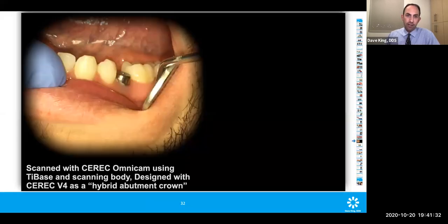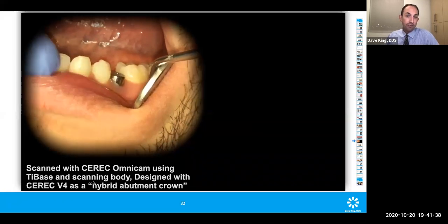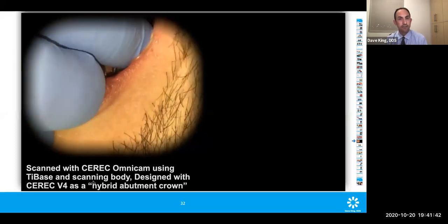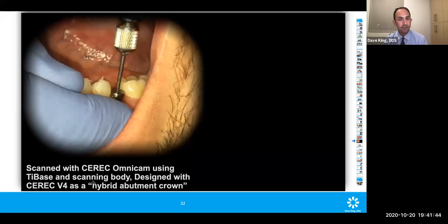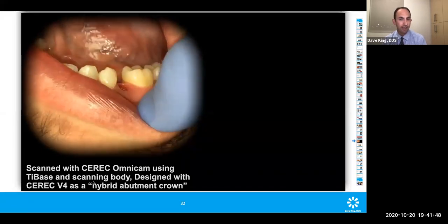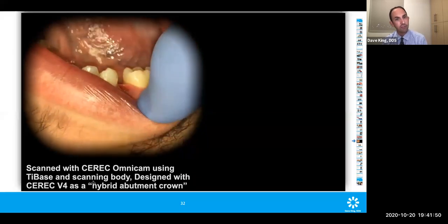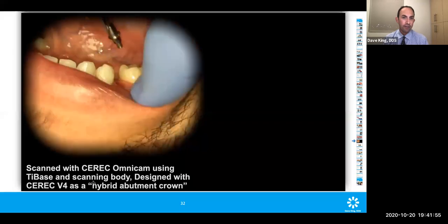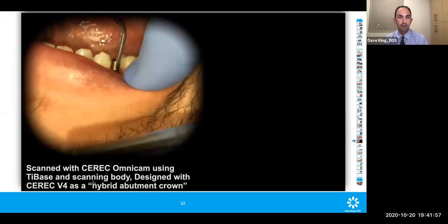All right, moving on. So I'm going to show you just a couple of videos of the actual scanning process using CEREC. So you can see me removing the healing abutment there. And this is one of my dental assistants in Albuquerque. We're going to take a look at the implant that's in place. And this implant was placed by one of my partners out there, Dr. Mark Urbane. Call him out. He's a great man. Had a lot of fun working with him.